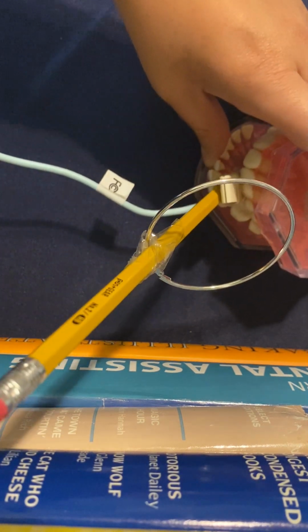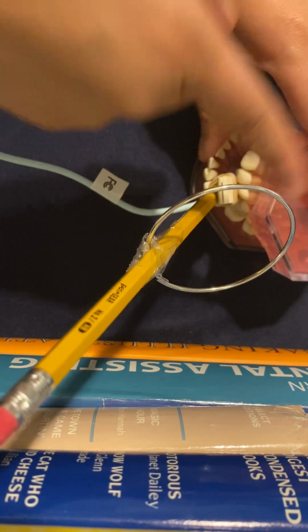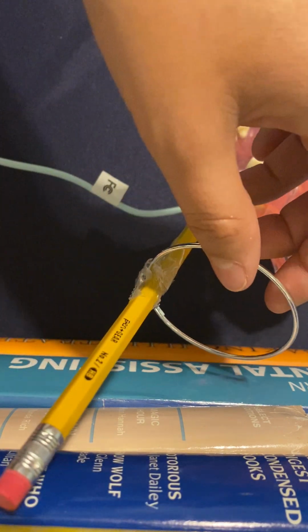And this is the corner of the nose, so his nose is right here, so pretend that's the corner. See if I can get that. So move that over a little bit more. So trying to get that corner of the nose, it'd be a very downward angle.